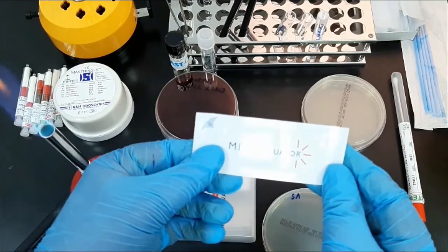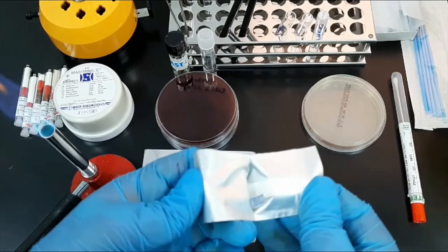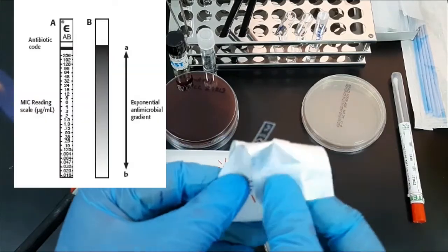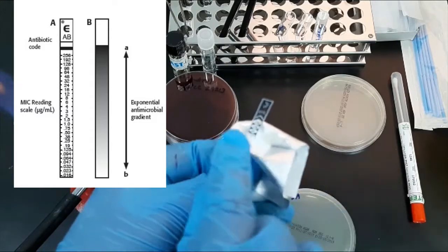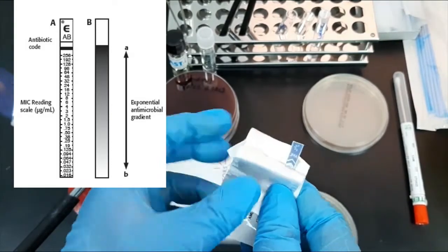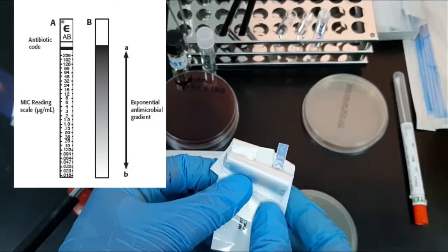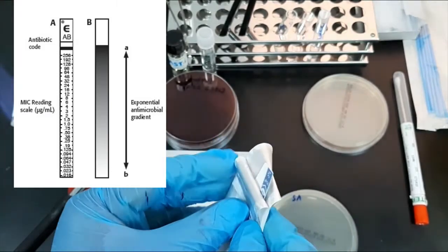Next, open the E-test packet and remove the strip. One side of the strip shows the MIC scale in microgram per ml and a code that identifies the antimicrobial agent. The other side, which shows in blue color, holds the antibiotic with the concentration maximum at the top and minimum in the lower part of the strip.